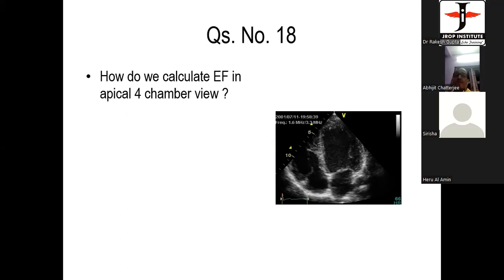Yes, sir. I don't know clearly, sir, but we keep measurements. Measure the left ventricular measurement, sir. Diastole and systole measurement. It is not left ventricular measurement that I am asking. I am asking you right ventricular measurement. Where do you measure the right ventricle? From septum to right ventricular wall, sir. At what level? At midpoint, sir.